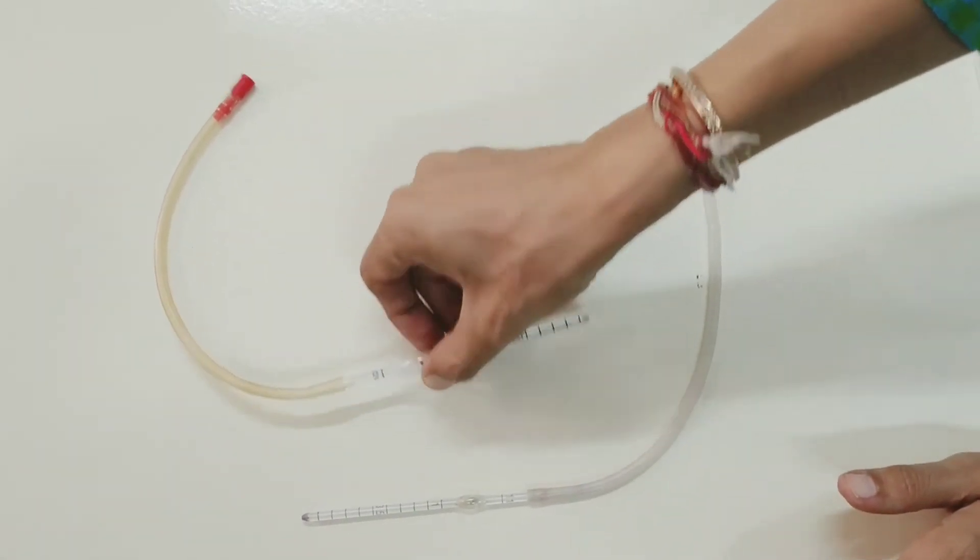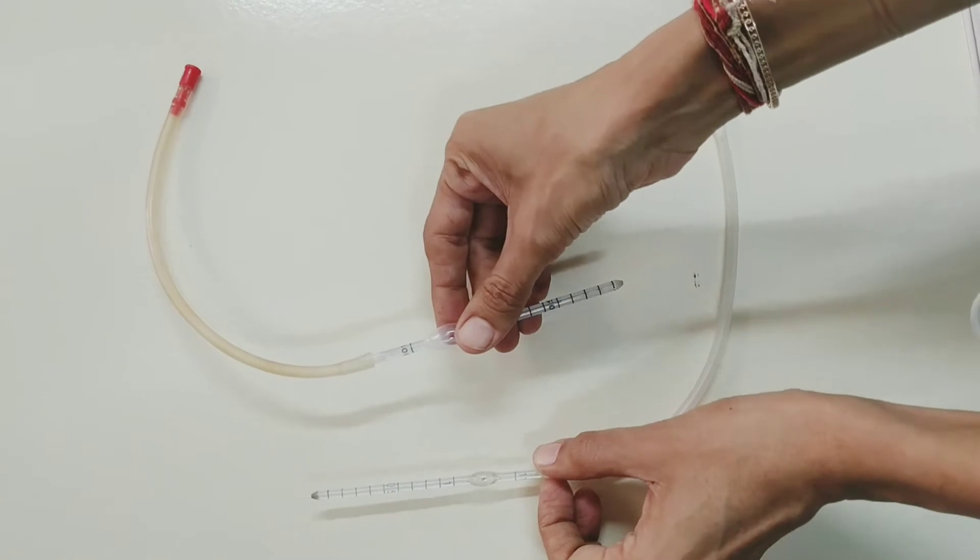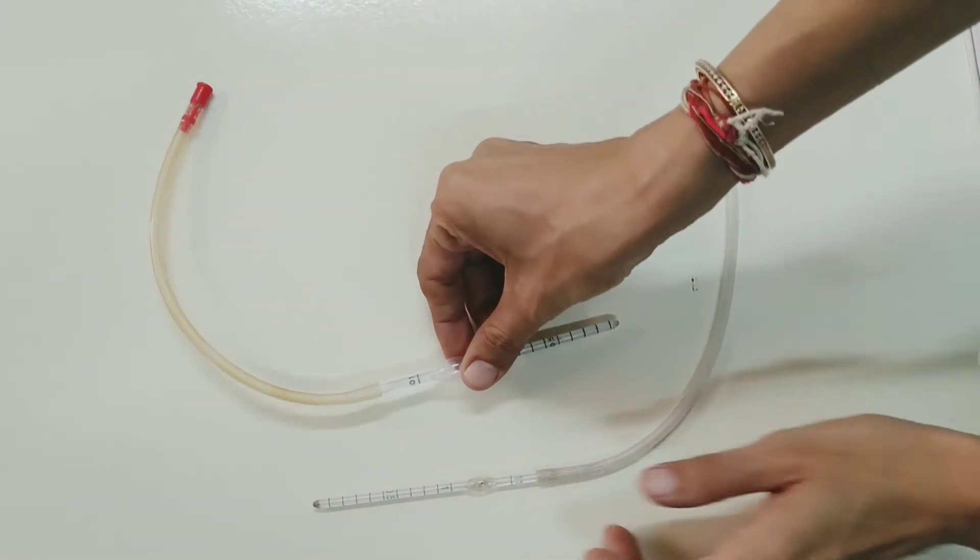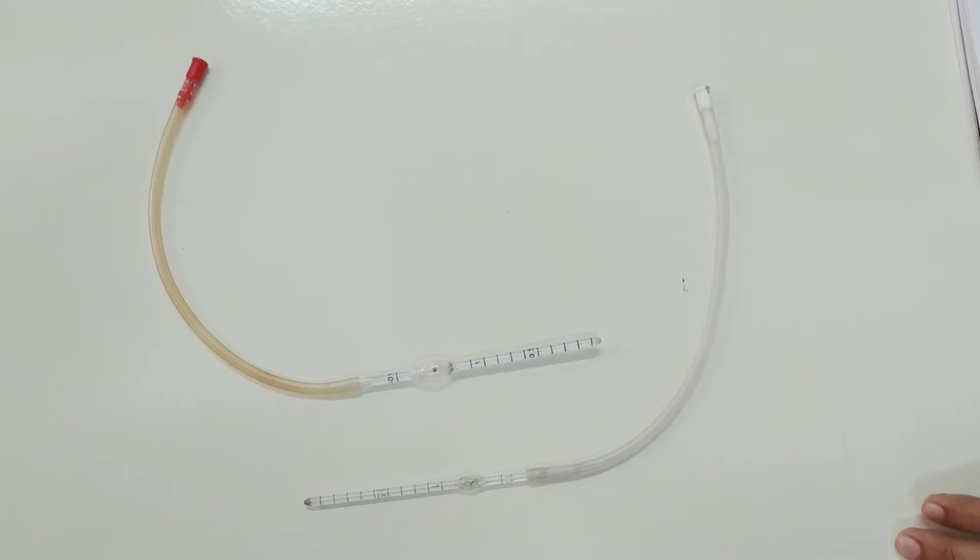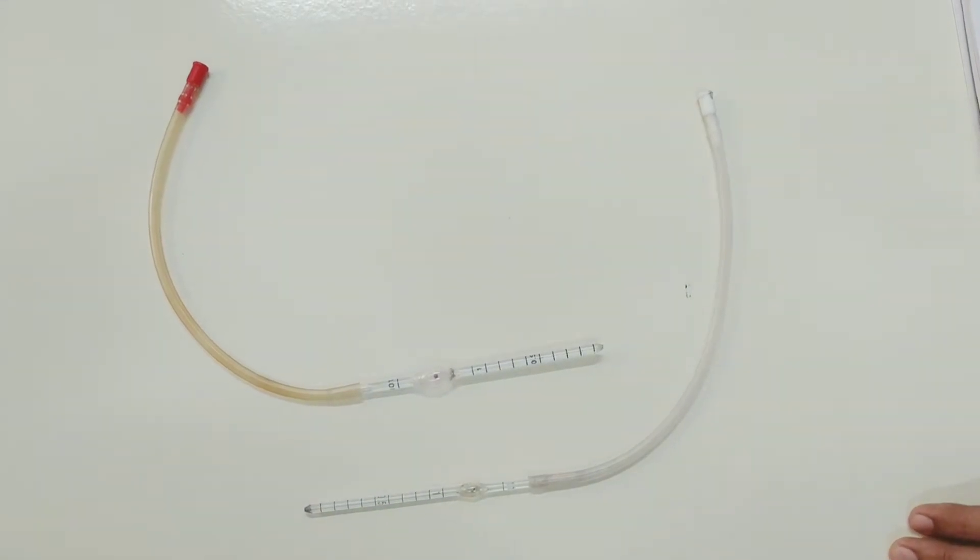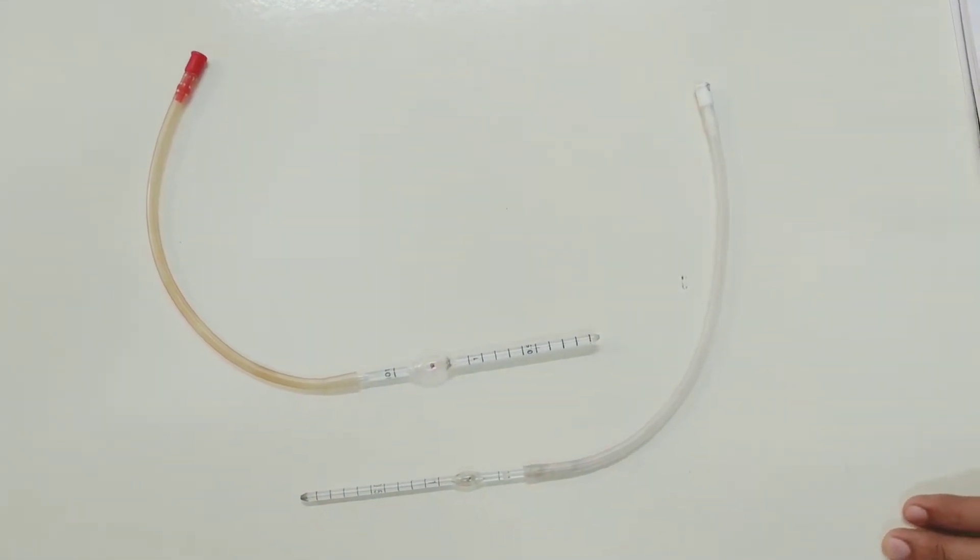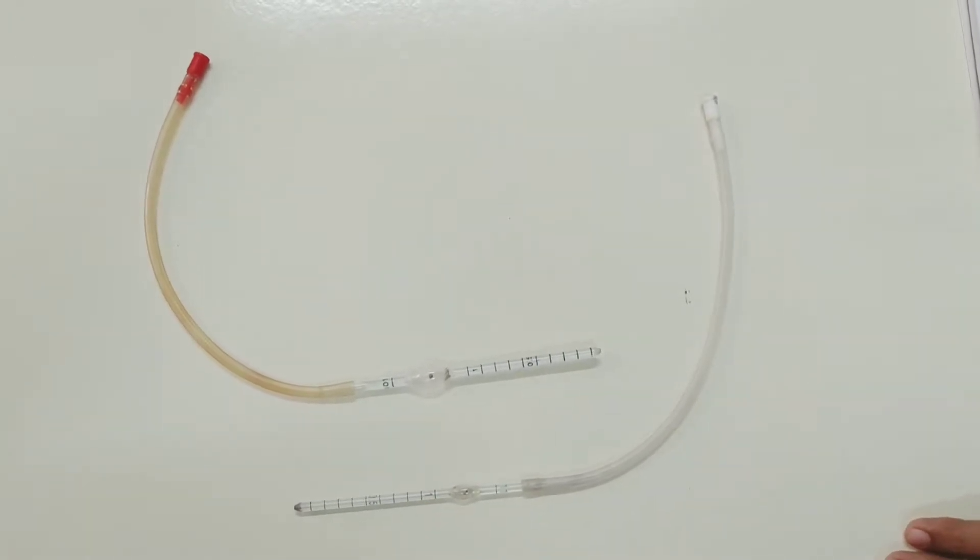This is an RBC pipette and this is a WBC pipette. These are two glass capillary pipettes used for dilution of blood. The pipette is used to dilute the blood with suitable fluid in an accurate known proportion.